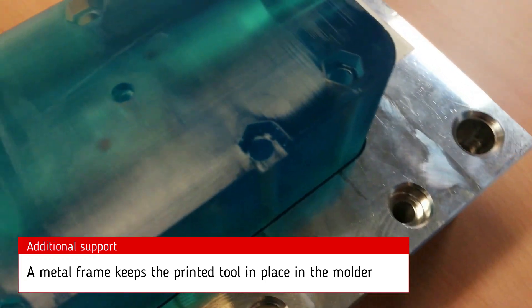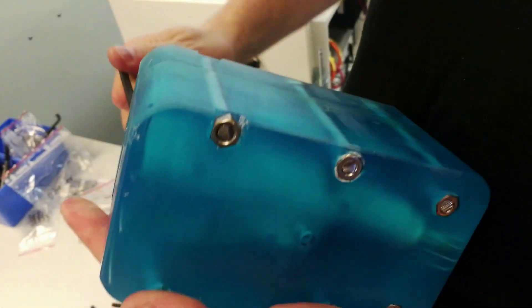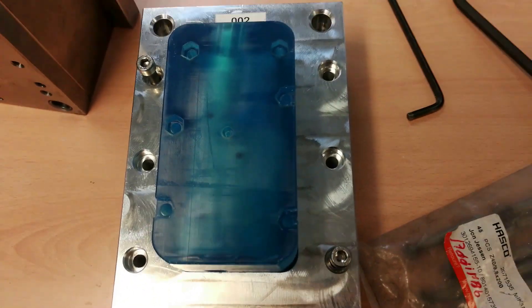As you can see here, we've got some screw holes. We add screws in order to keep the mold together. All these efforts are needed to ensure that we get a precise and highly repeatable result when we inject.